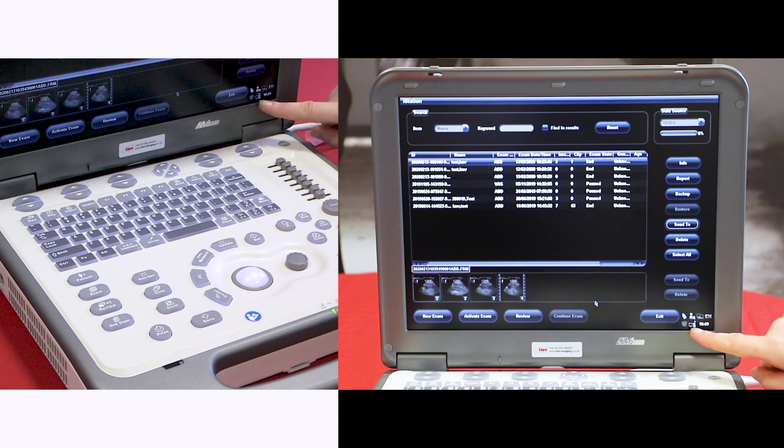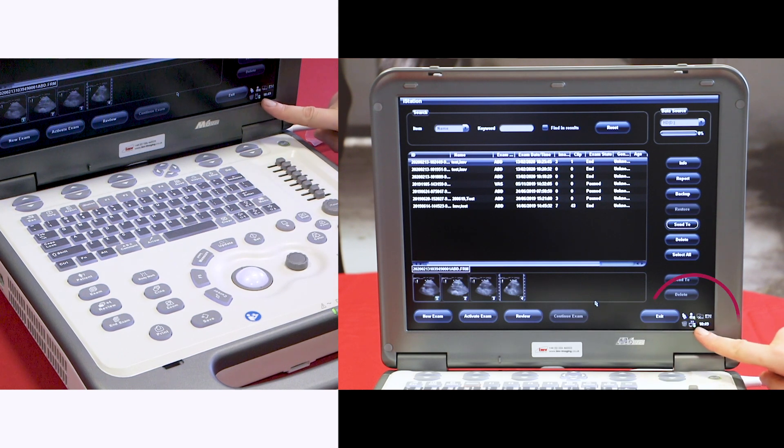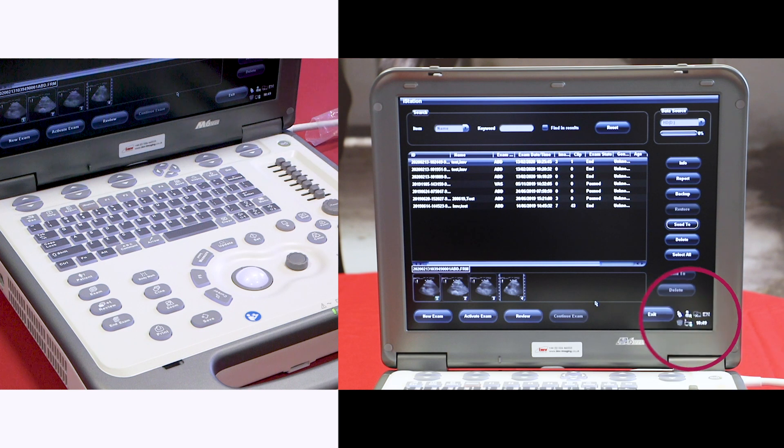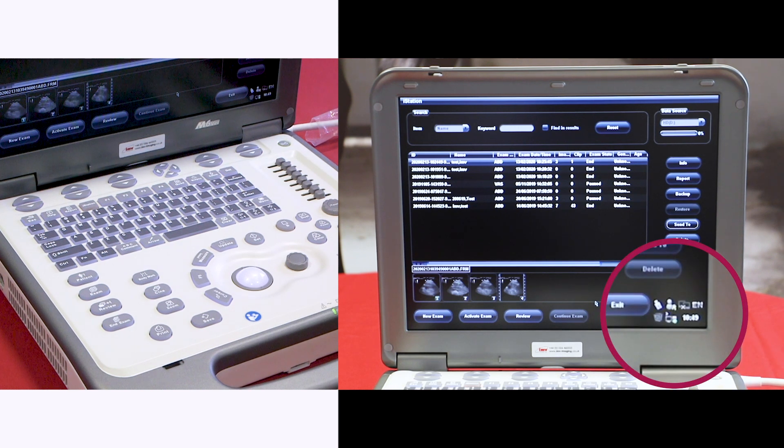And this little arrow here means that the images are moving over onto your stick. When it's finished, the images will be moved over.